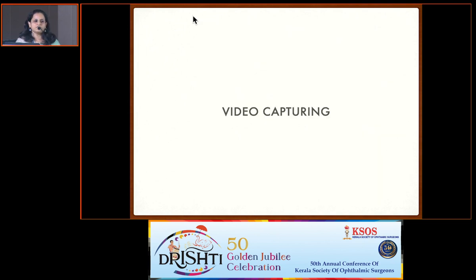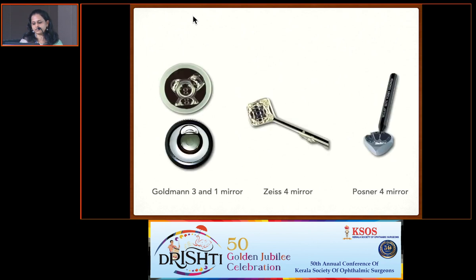But now we have all gone paperless. Now everything is shifting to the EMR. So having this goniogram is a little difficult. So the next era is of video capturing and photos, which we have already seen many photos. So video capturing is to document your findings, convenient for patient education and easy integration into network.